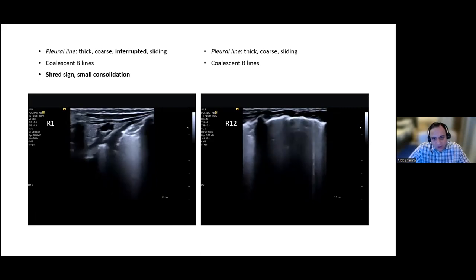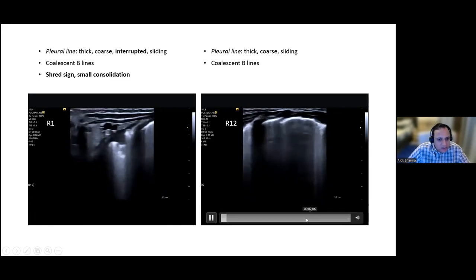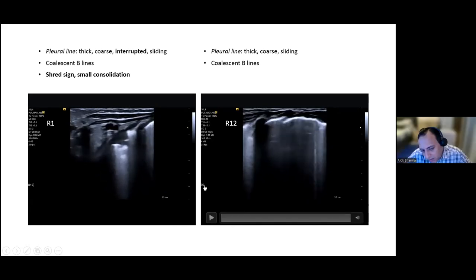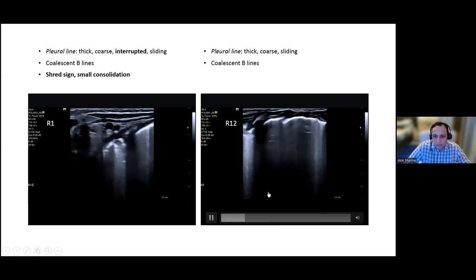When I come to R1, R2, again, you've got a very nice machine. You're losing a little bit of depth just at 3.5. What frequency are you using? 10. That's beautiful. You've got an image of R1, R2 at a frequency of 10. You could bring it down a little bit to get a better, deeper image.